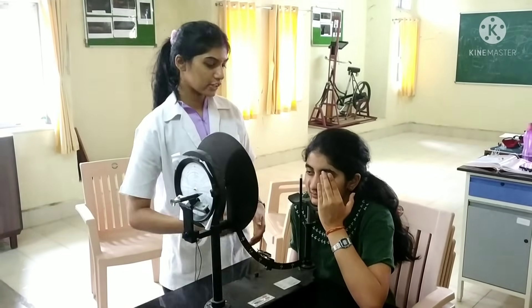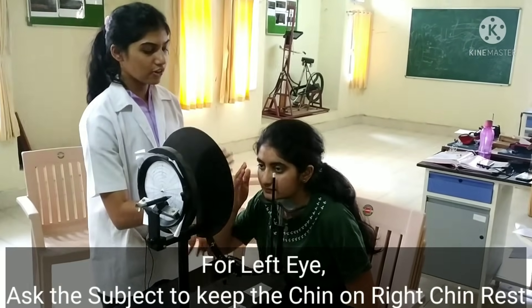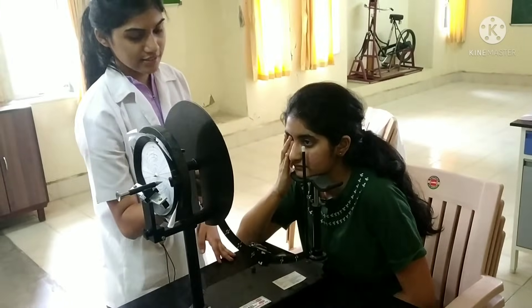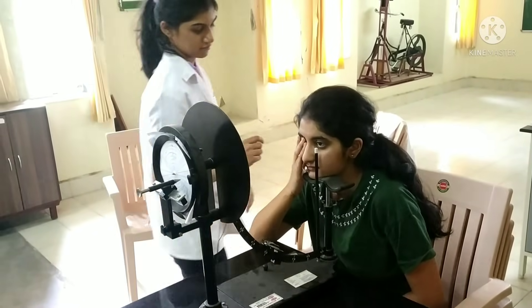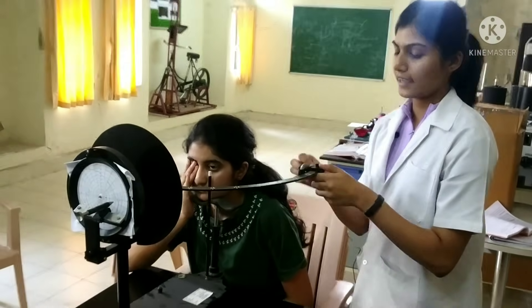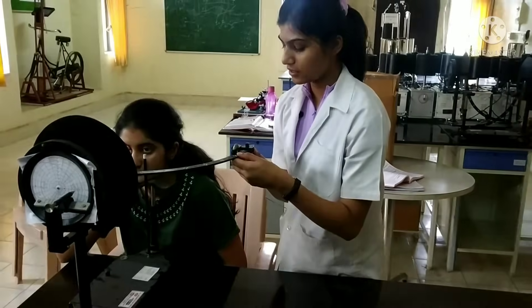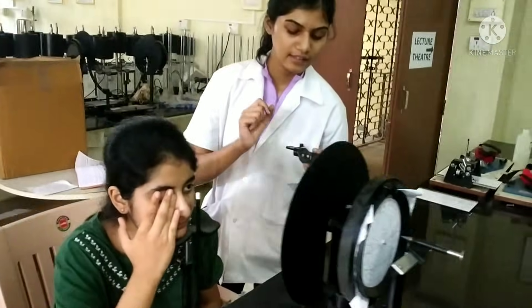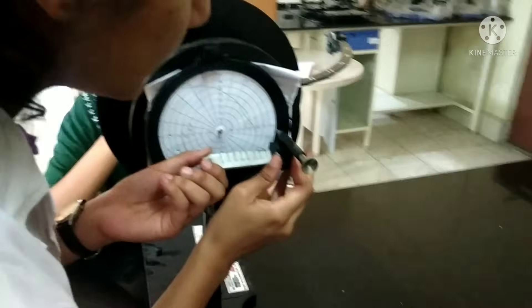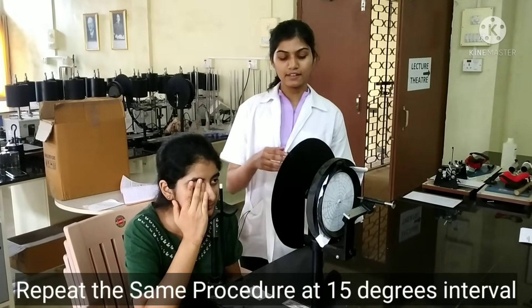Now we will calculate the field of vision for the left eye. The subject keeps the chin on the right chin rest and covers the right eye. The rod is fixed at the lower eyelid level and the gaze is fixed at the central white point. We start with the temporal side — for the left eye this side is temporal, and the other is nasal. Our reading for this position is 85, which we mark on the chart. We will take readings for every 15 degrees.